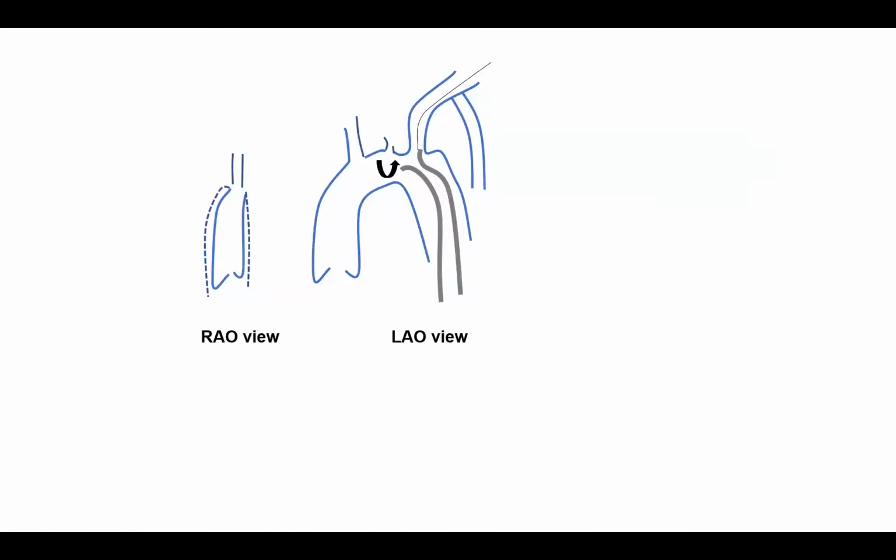This is one of those you absolutely need to memorize. I ask sometimes third-year fellows and they give me the wrong answer. Is it clock or counterclock? You absolutely need to memorize this. It's counterclockwise. It's always counterclockwise rotation. It's one of the constants here. So you pull with a counterclock so that your counterclock gets transmitted as you're pulling, somewhere in the range of 90 to 180 degrees.